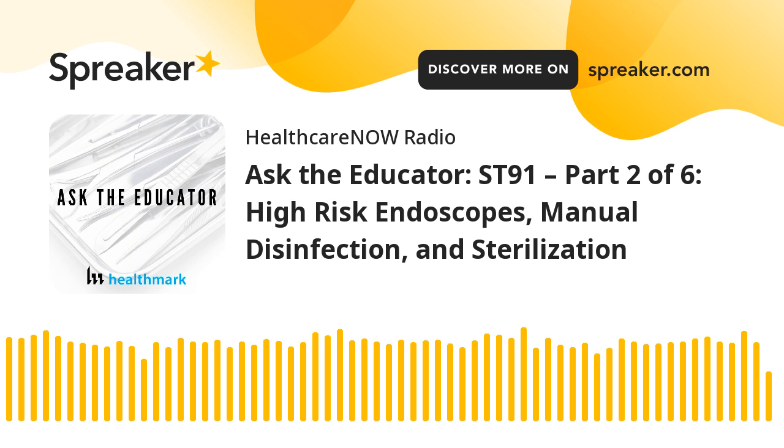But I will tell you, by making that change and that distinction between high risk and non-high risk scopes, we do see a lot of facilities that are moving to testing every scope every time, regardless of whether it's high risk or not, because you're taking that interpretation out of the picture. You're not asking technicians to memorize a list of what's high risk and what's not, or refer to a list.